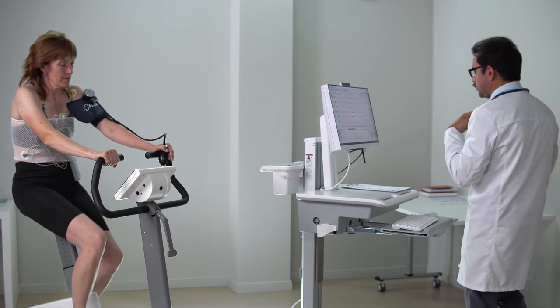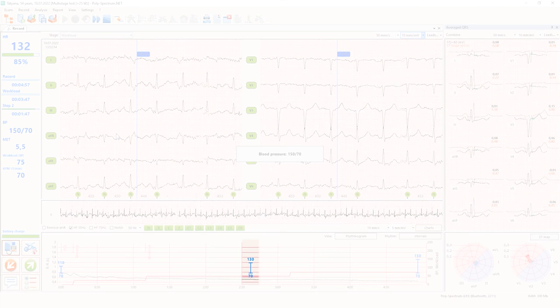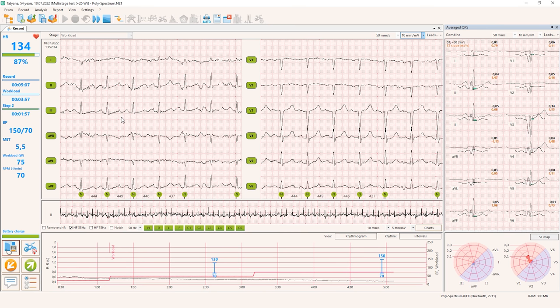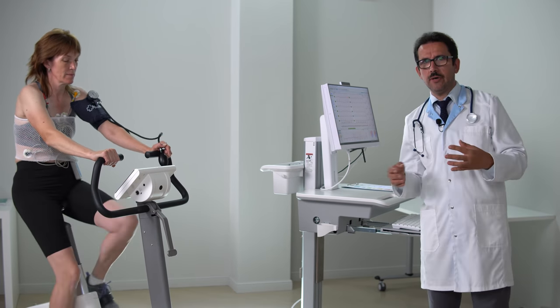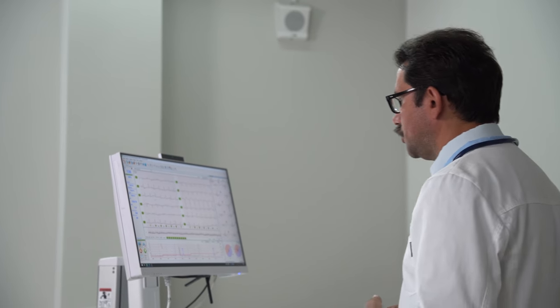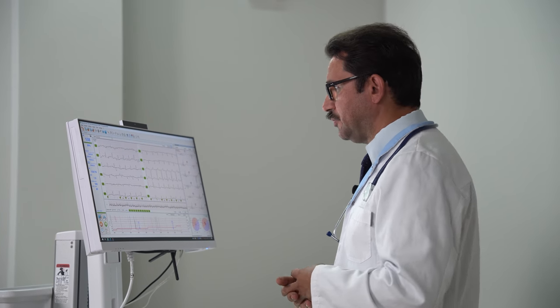So the normal reaction is increasing systolic blood pressure, with the diastolic blood pressure the same as at rest, or maybe a little bit decreasing, a little bit increasing. That's why I would recommend you not to tell the patient the actual numbers, because some may be confused or worry about the high blood pressure during the test. That's a normal reaction, but you will spend a lot of time explaining the physiology to the patient. It's not a good reason to start this explanation during the test. It may be later when you explain the results to your patient.